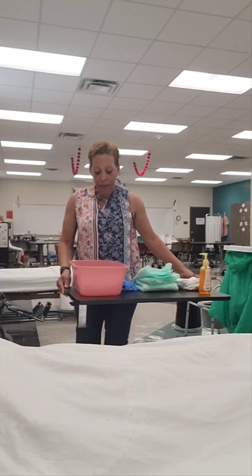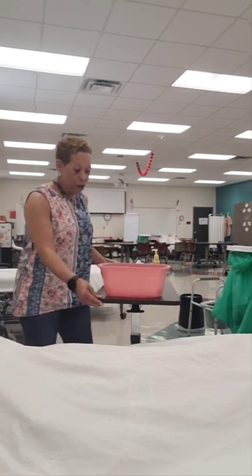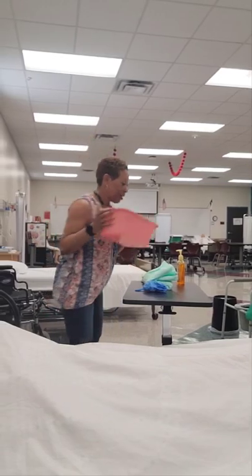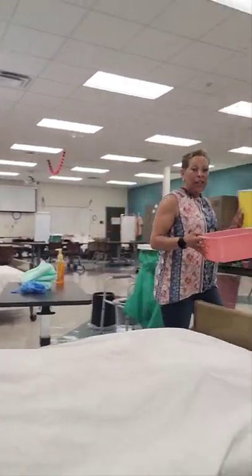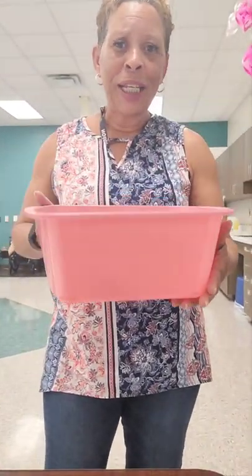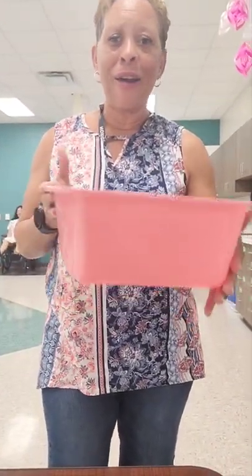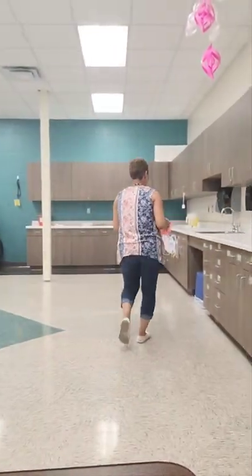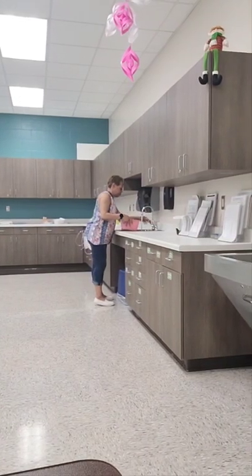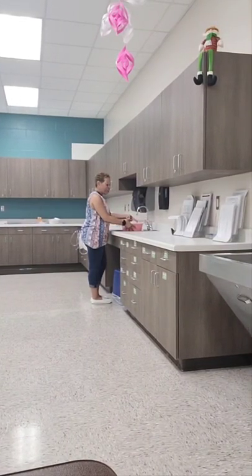Mrs. Jones, I have all my supplies. I need to go fill the basin with water and I'll be right back. When I fill the basin I'm not going to put a lot of water in it — you don't need a lot for catheter care or peri care — so I'll fill it up to about right here. I'm testing the water.